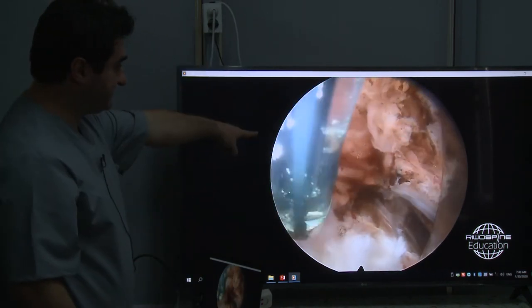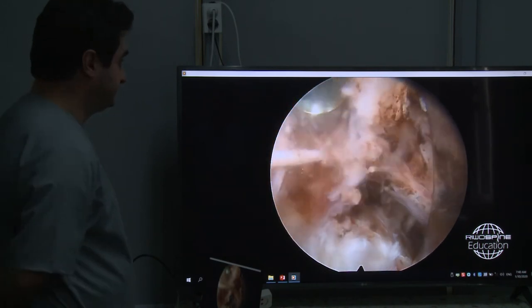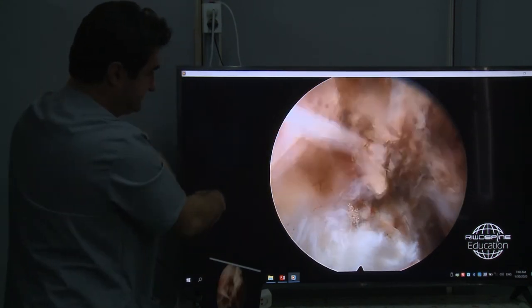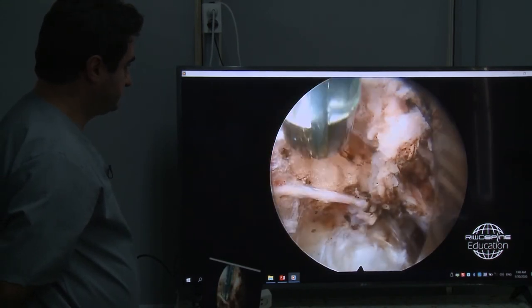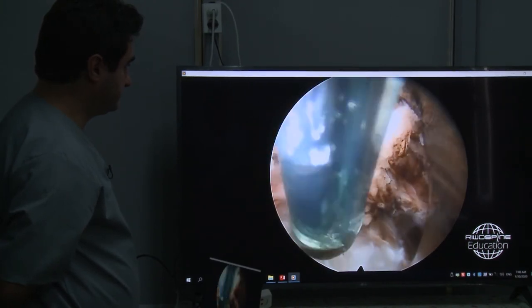If you dissect that fat tissue, you will find the exiting nerve there. This fat tissue, this is the left side. We are on the left side, cranial side, caudal side now, dorsal and the disc space. That's the way you can do that after a normal decompression, and you can practice it.